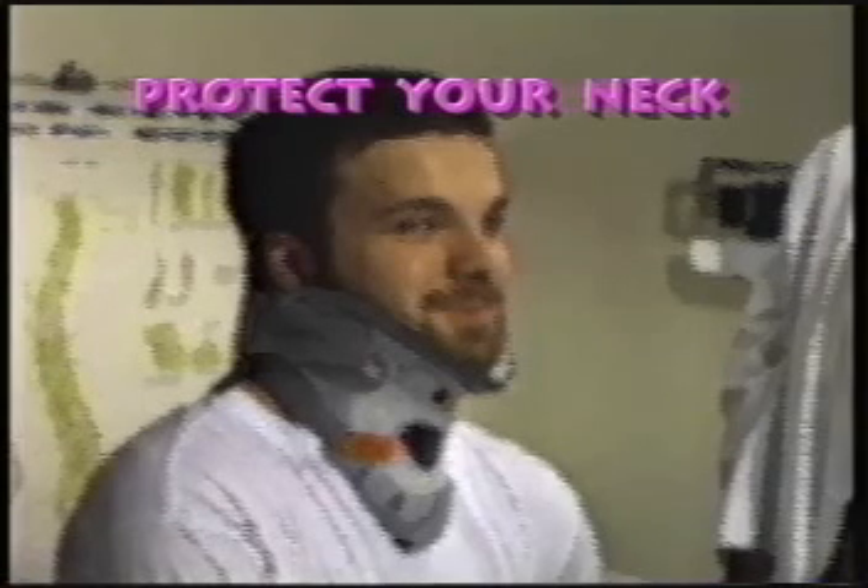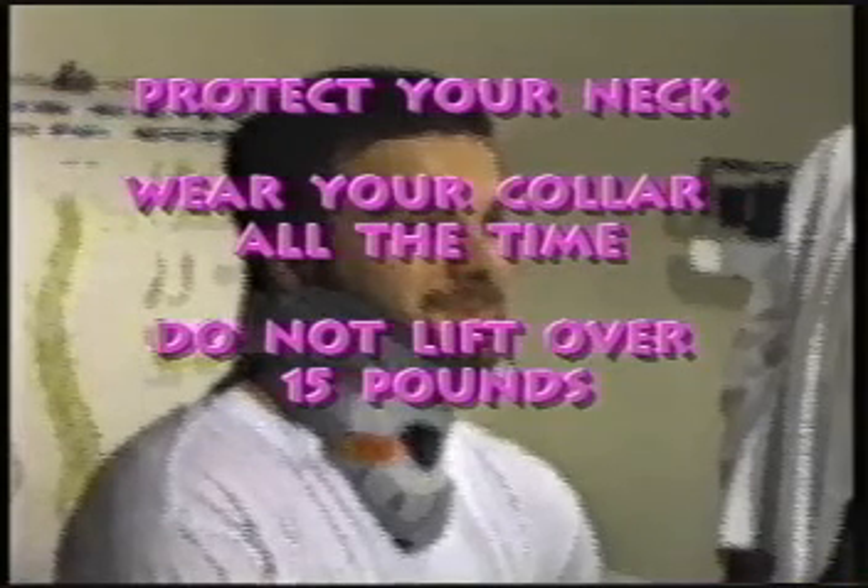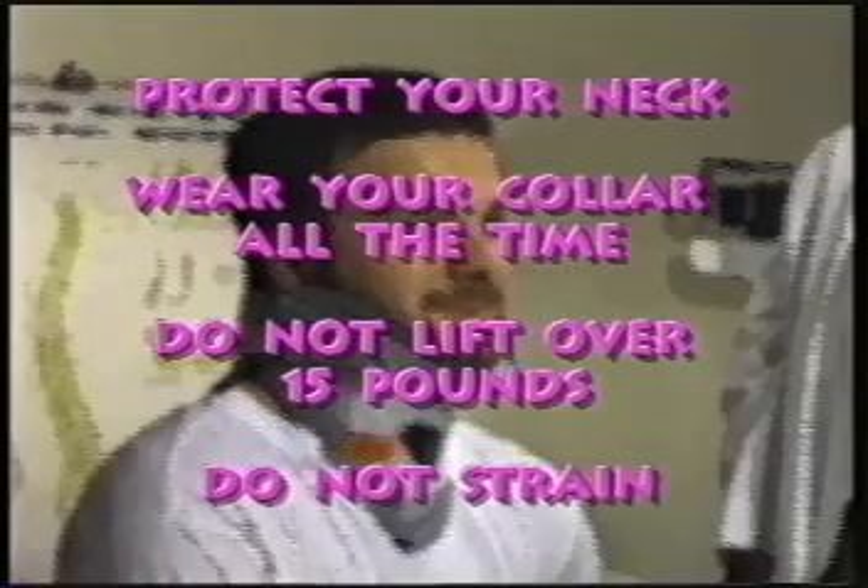This normally takes around 2 weeks. During this time especially, you will need to protect your neck. Wear your collar all the time. Do not lift anything over 15 pounds, and do not strain.